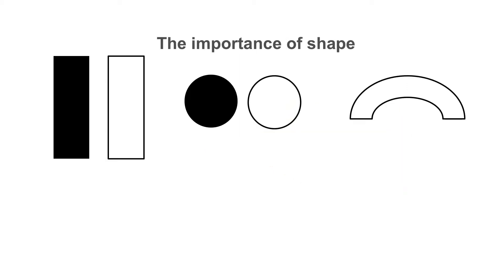The thoracic anatomical structures are three-dimensional and course in various directions. Depending on their anatomical course and geometry and the direction of the X-ray beam, they will form shapes that are predictable. This forms the basis of object recognition on chest X-ray examination.